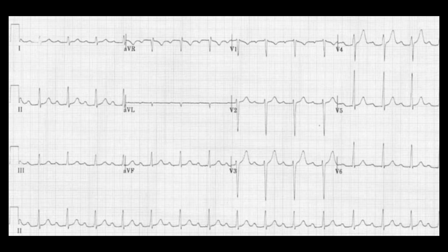Next is important for evaluating blocks, specifically atrioventricular blocks. So for example, first degree block, the PR interval is fixed and greater than 0.2 seconds.